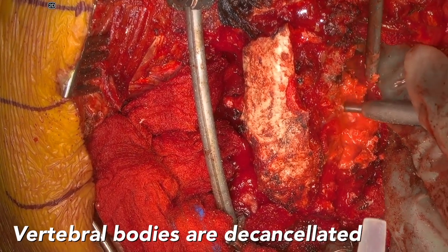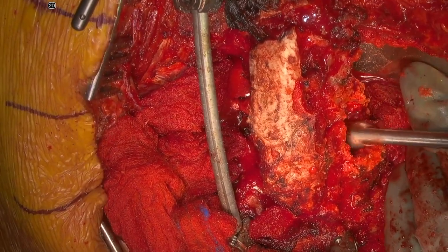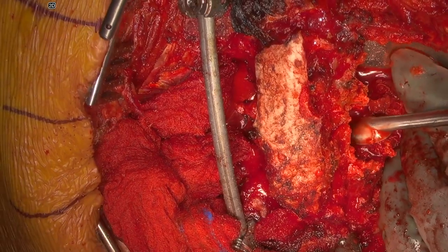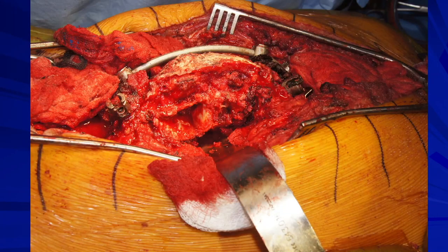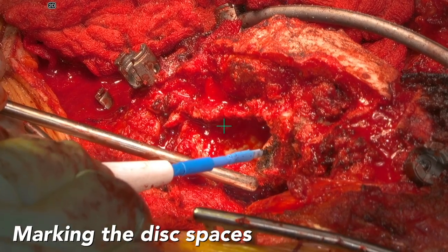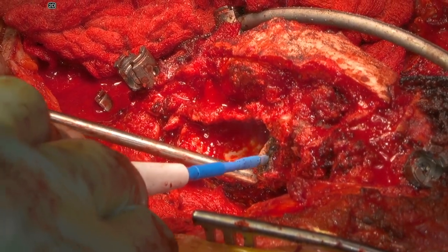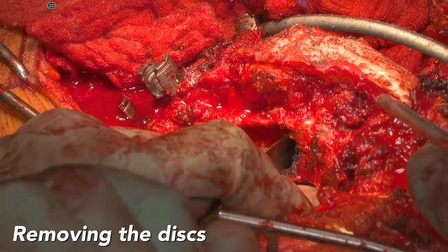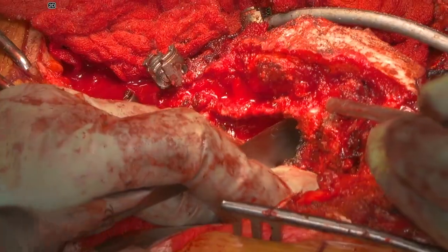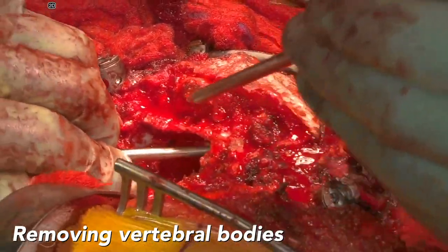Now the vertebral bodies are decancellated with a burr and also using various size curettes. In this portion of the video, the posterior wall is still intact. The vertebral bodies have been removed. Now the disc spaces are identified and the cartilaginous endplate is removed with a Cobb elevator, rongeurs, and curettes. This provides a very clean bony surface superiorly and inferiorly where the anterior spinal fusion is going to take place.